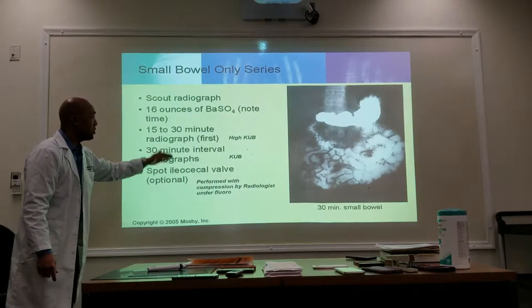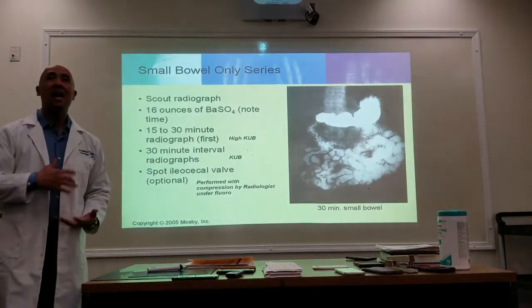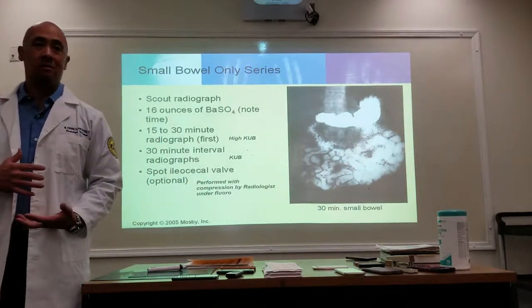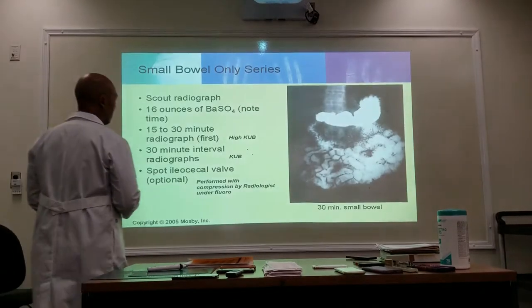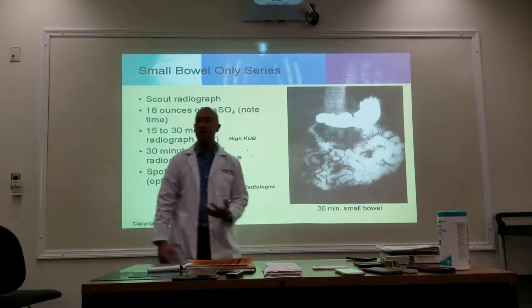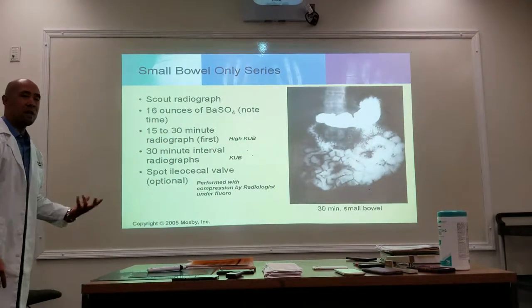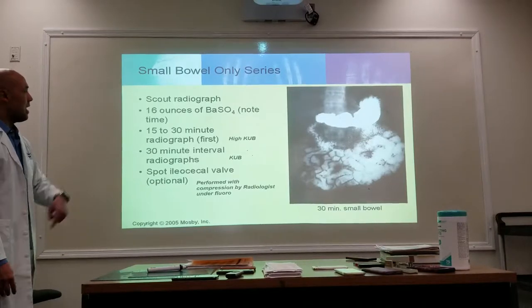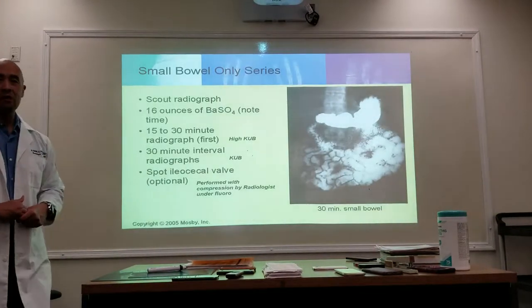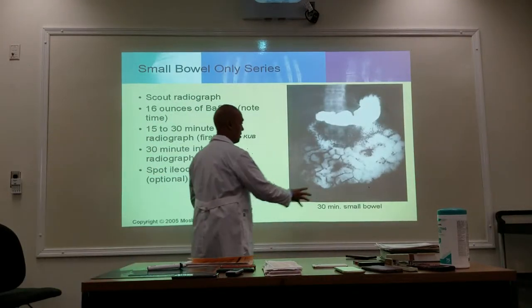For the first few shots, this is what it's telling you: you're going to be taking high KUBs. Okay, because the contrast should only be filling the stomach and maybe just the proximal portion of the small intestines. So your first couple of shots are going to be high KUBs. Then you go down to a regular KUB when the distal segments of the small bowel start to fill up.